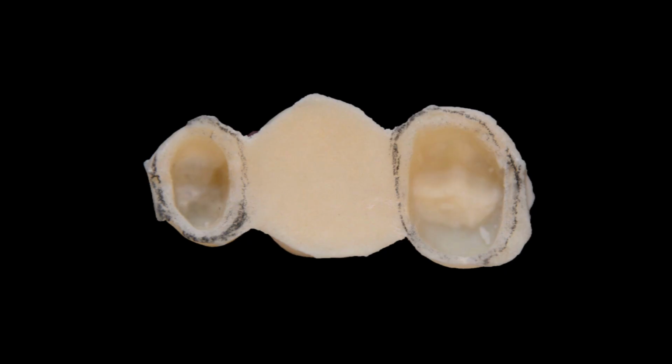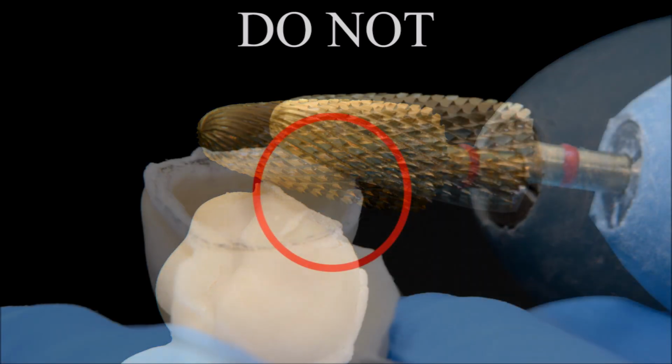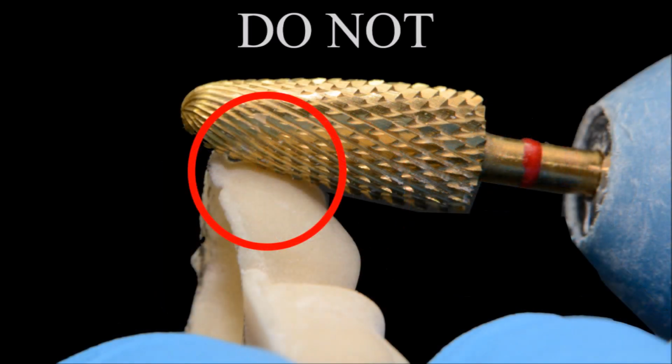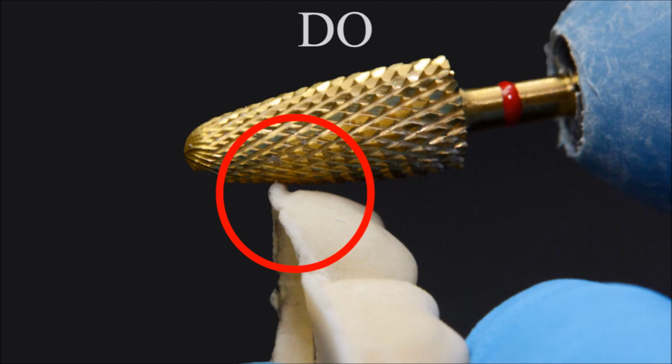While trimming off the excess, some precautions must be followed. Do not hold the provisional in a manner that you cannot visualize the finish line. This may result in inaccurate trimming of the finish line thickness. Do not hold the burr perpendicular to the long axis of the provisional. This would result in a discrepancy at the finish line area. Do not trim off the axial contour of the provisional while adjusting the thickness of the finish line. Holding the burr at a mild angle enables visibility of the finish line while avoiding reduction of the axial contours of the provisional.